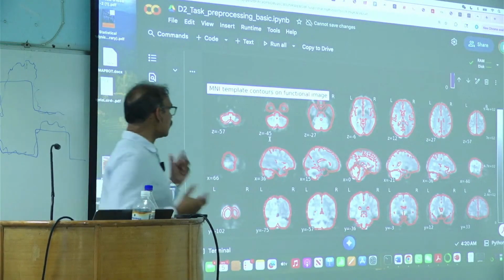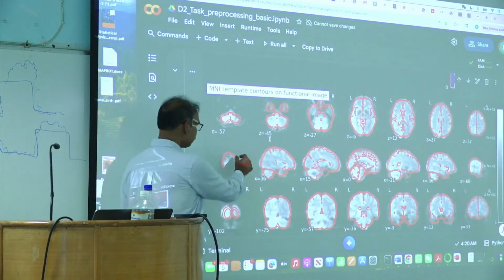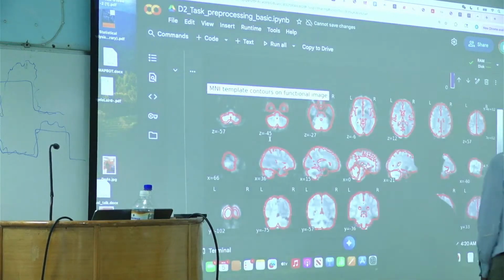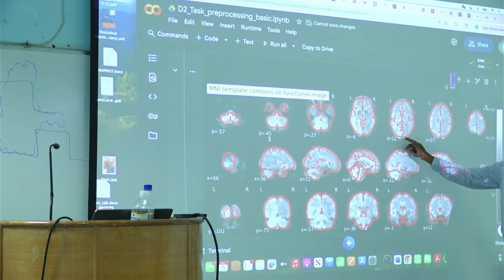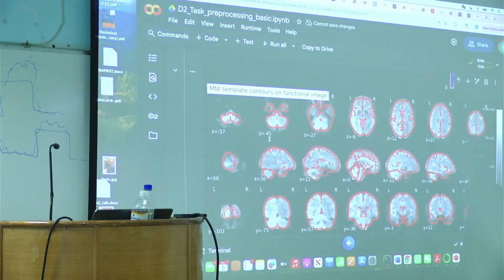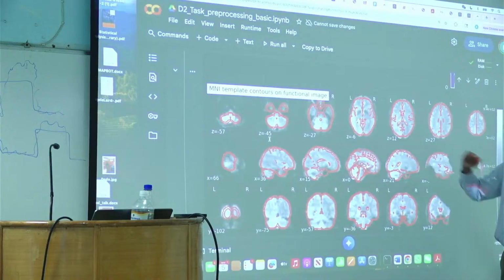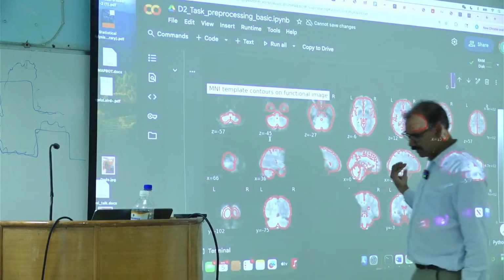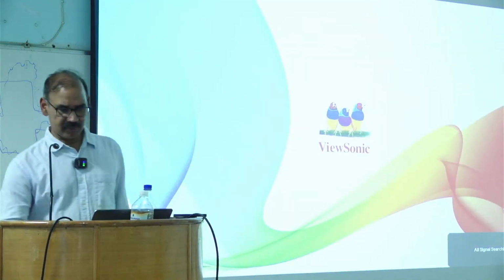So let's say you saw activation someplace like here, right? Yeah, let's say something around here you saw activation. Then it's very unlikely that it would be from the subject pertaining to a specific task.